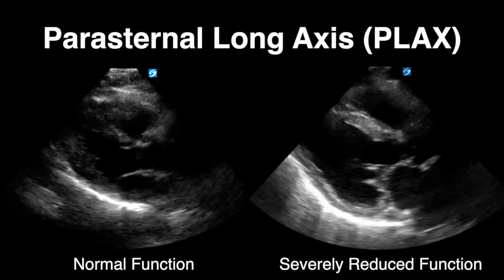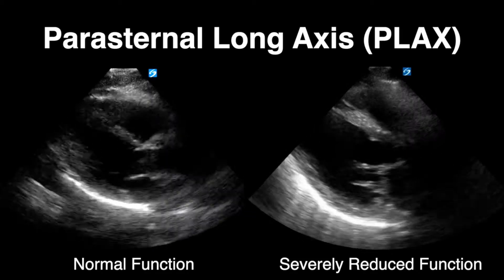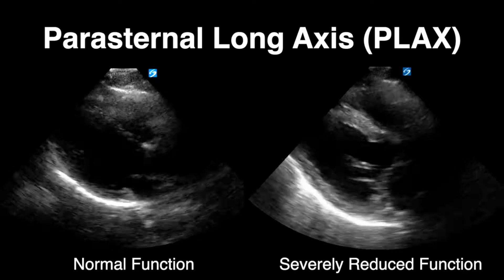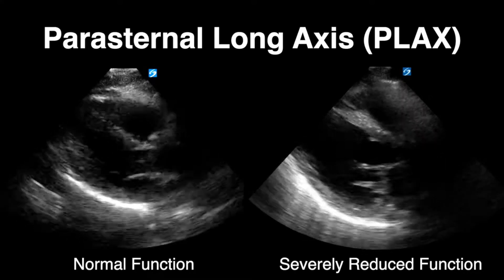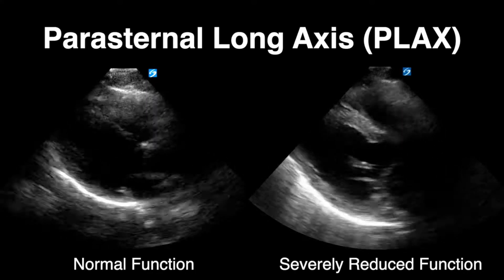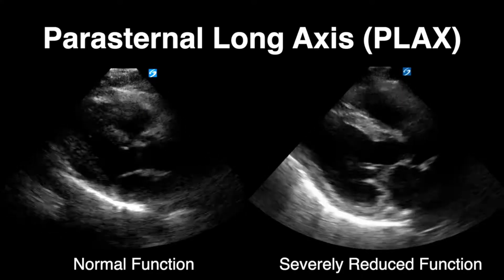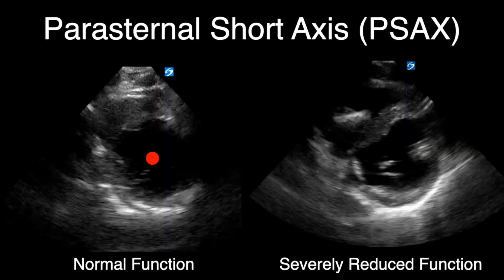Keep in mind we don't rely on just one view for determining function because we may be limited in what walls we're seeing. Moving to the parasternal short axis, I like to think of a small red dot in the middle of the left ventricle and evaluate how well all the myocardial walls collapse down toward that dot.